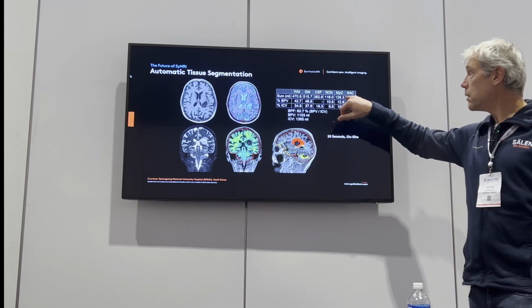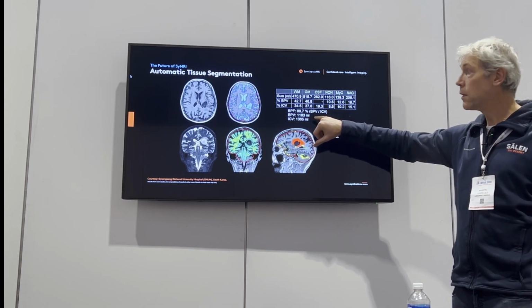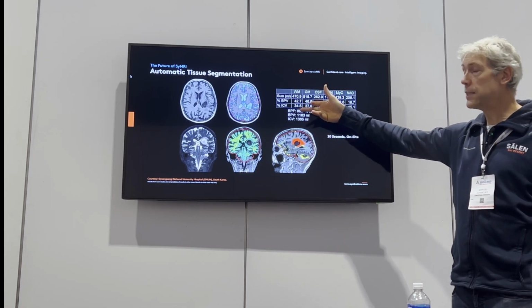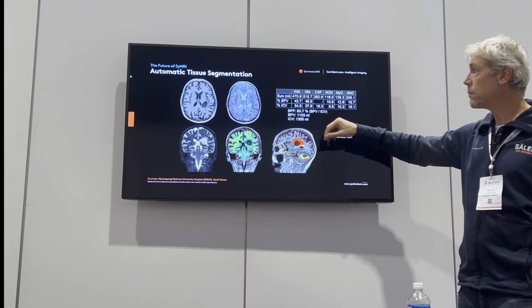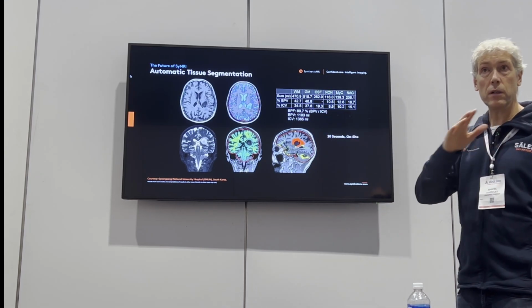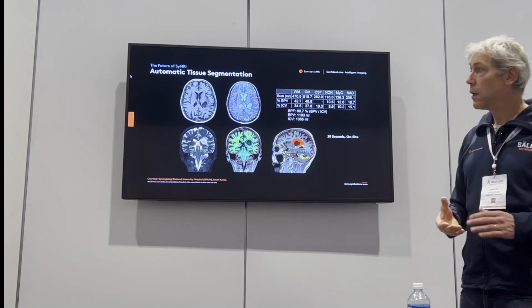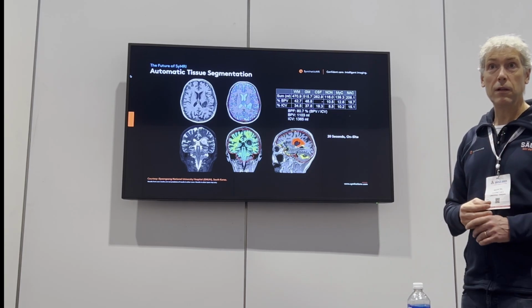So these are the sums. This patient has a brain volume of 1103 milliliters. It's an intracranial volume. We usually take the ratio of that, the BPF, brain parenchymal fraction. This is a very good number to monitor over time, considering the ICV is stable. We have a repeatability error of 0.2%. So for us, it's stable.